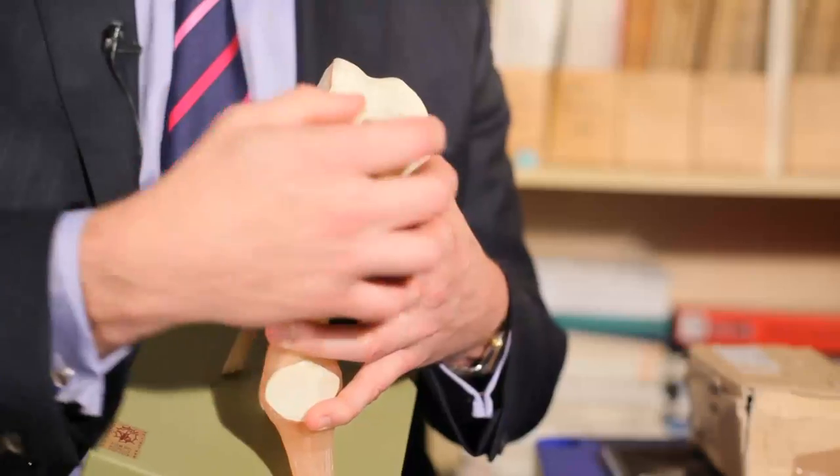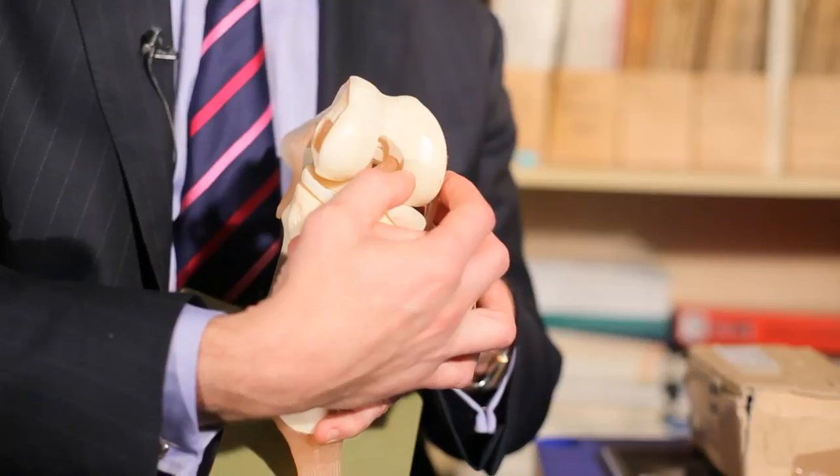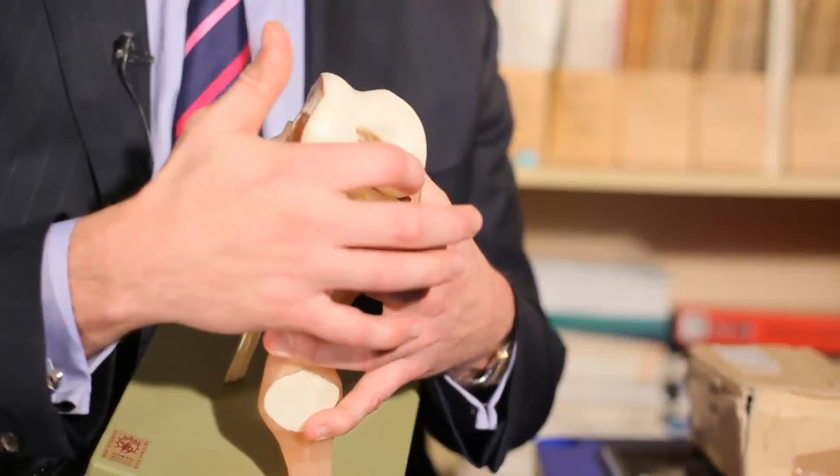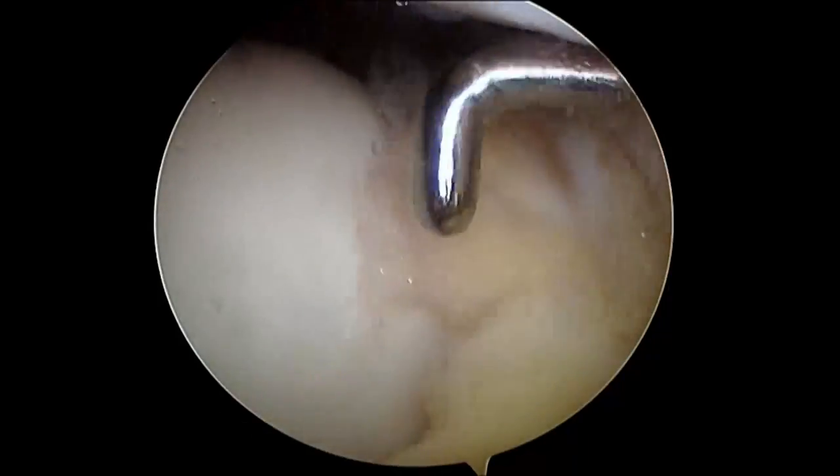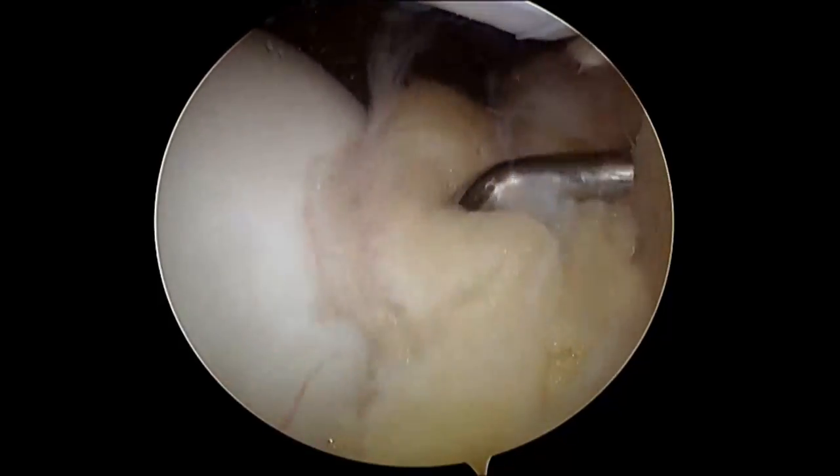Sometimes there are certain situations where we want to know, if there's a specific problem to one side of the joint, how good the other side of the joint is. An example is if someone has bad arthritis affecting just the inner side of the joint — can we offload their joint onto the good side by doing an osteotomy? Before we proceed with that operation we would have a look first to assess, usually as part of the same procedure.